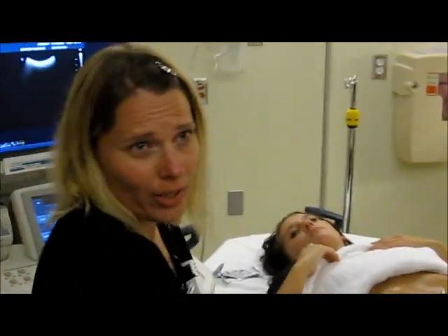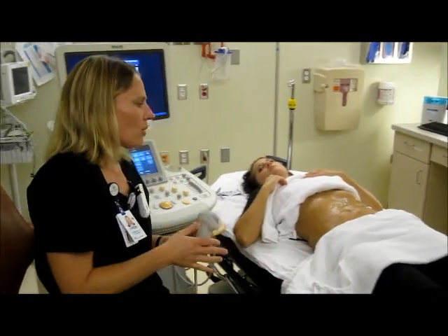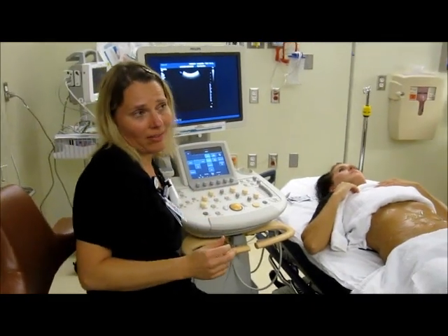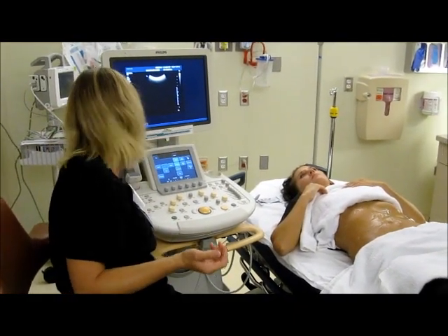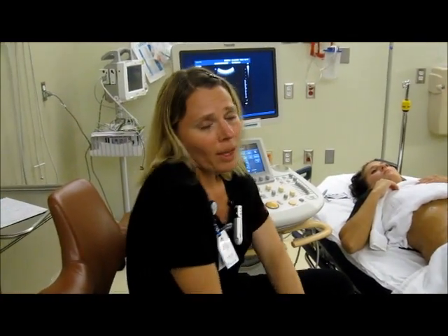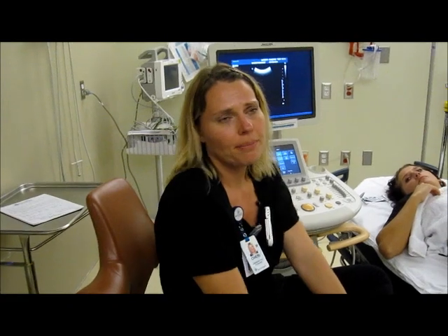They want to know anything else. What are some of the most common mistakes that PAs like us would make in ordering an abdominal ultrasound? Just ordering the wrong kind of exam. Depending on where the patient's pain is or what you're looking for, there might be another modality in radiology that's better. Like I said, with kidney stones, we're not the best for kidney stones. CT is better. But there's a contraindication in having a CT, like they're pregnant, is the biggest reason. When they're allergic to the CT contrast, if they're allergic to iodine, then they can order an ultrasound. We may not be able to find a kidney stone if they're small, but we can still look because we don't have any radiation.